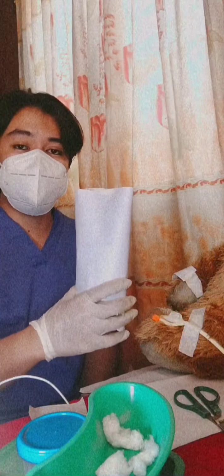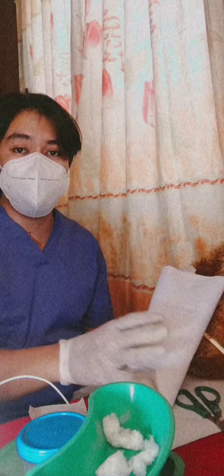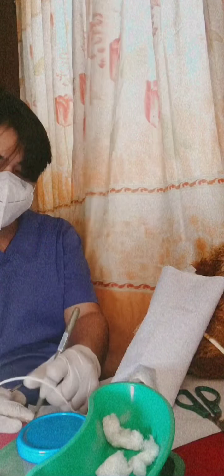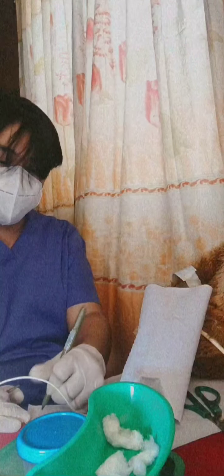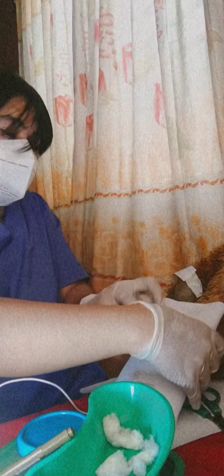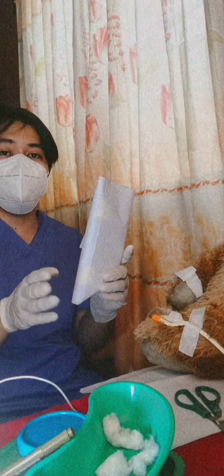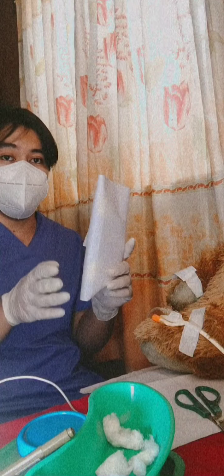Next, we need to prepare a sterile irrigant bag according to the manufacturer's directions, and then we need to label it as bladder irrigant, and then include the time and date, and then place it on the bag, and then hang it on the pole 2.5 to 3 feet above the level of the patient's bladder.